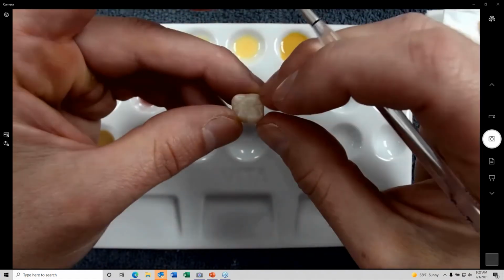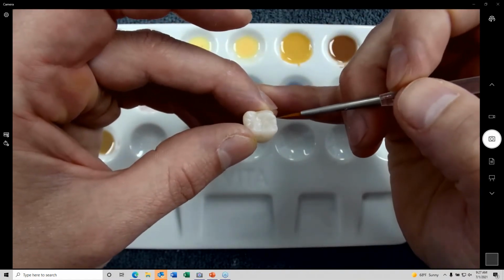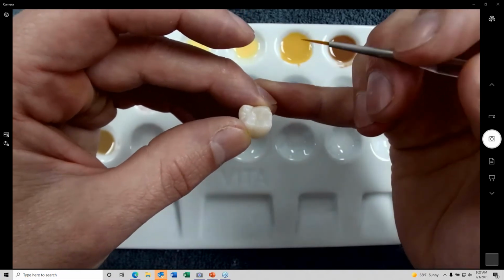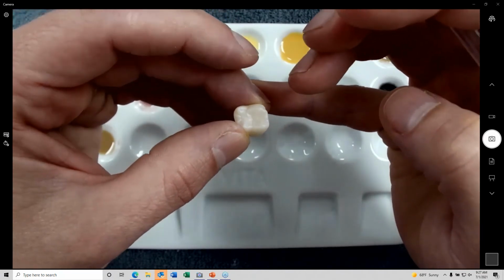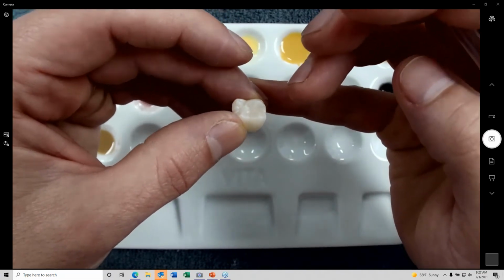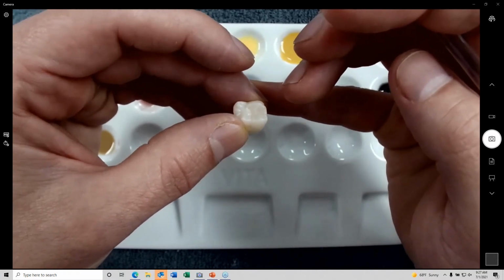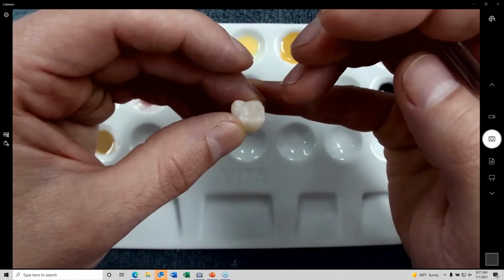Sorry, what was I saying? Yeah, so the surface is very abrasive, that we never want to use raw zirconia against natural dentition. It is like sandpaper and it will absolutely destroy the opposing tooth. The absolute best way to finish zirconia is to very high shine polish it. That is the best finish surface against natural dentition.